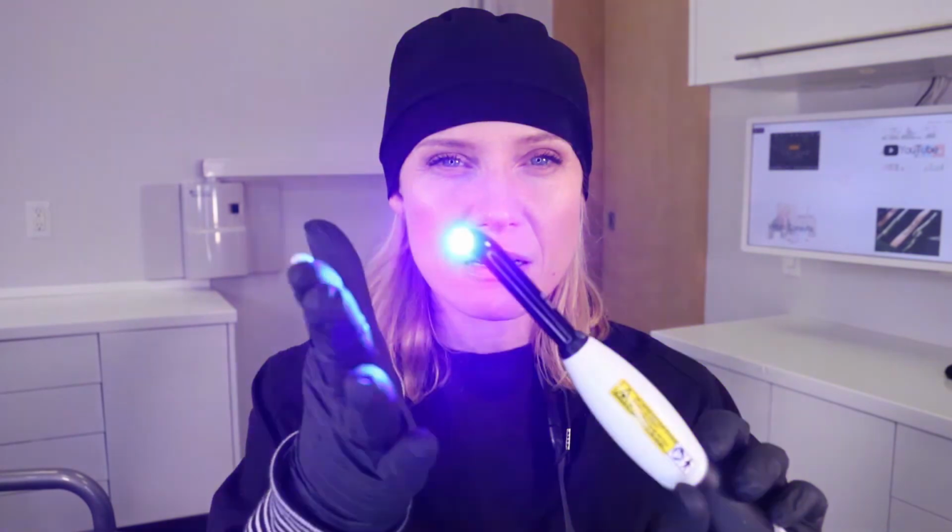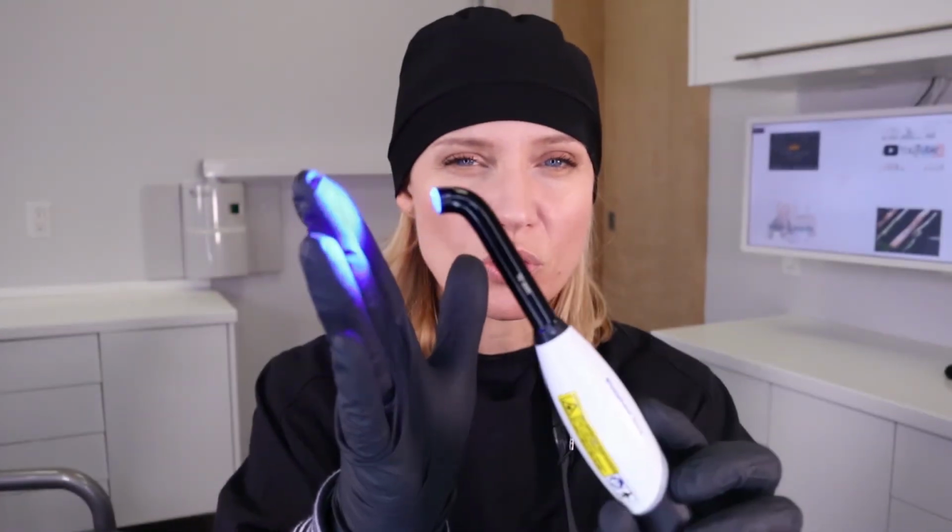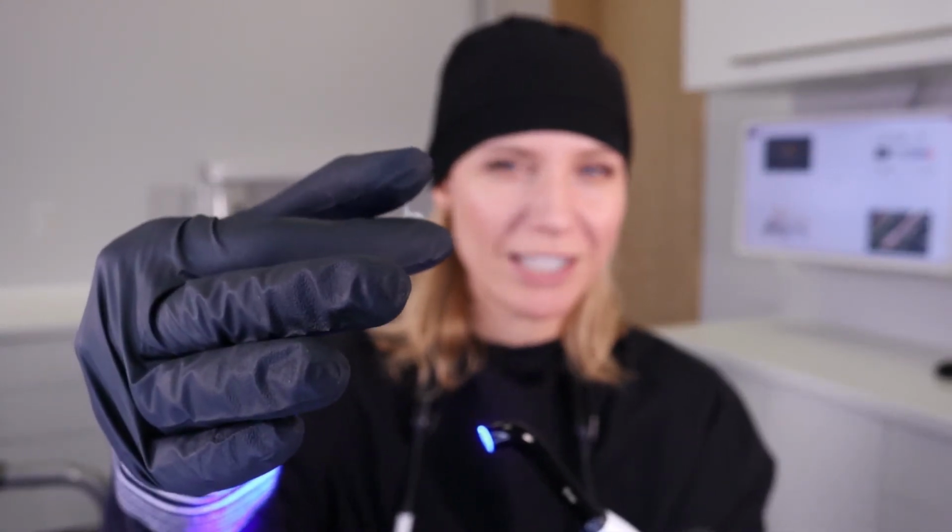Now, if women have ever gone to the salon and gotten their nails done and any kind of curing, we use curing lights. So you can see here, this is a special light, and right now the material is very soft still, so you can see. I don't know if you can see that. It's super cool. Like if you like to play with gooey things, then dentistry is your field.